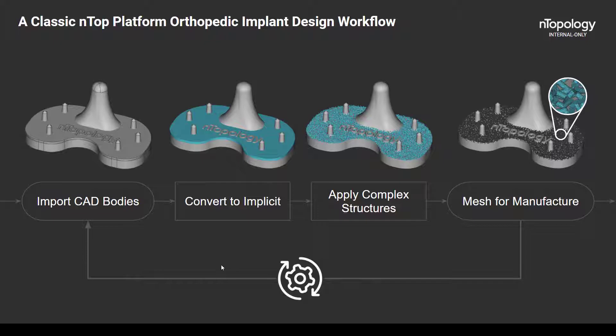The next step is to convert to the implicit format. In case you don't know too much about our implicit modeling technology, it is a really lightweight and efficient way to manage and modify geometry, especially when complex processes such as topology optimization and latticing are deeply involved. Converting your parasolid model to our implicit data model is what will make the lattice generation process really fast and repeatable for all of your part configurations.